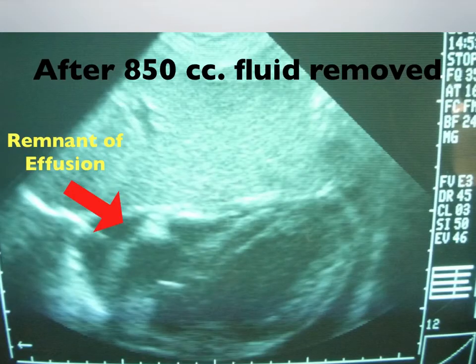This is the ultrasound after the fluid was removed, and you can see over here that there's just a remnant of the effusion remaining, and 850 cc's were removed. The patient's symptoms immediately went away.